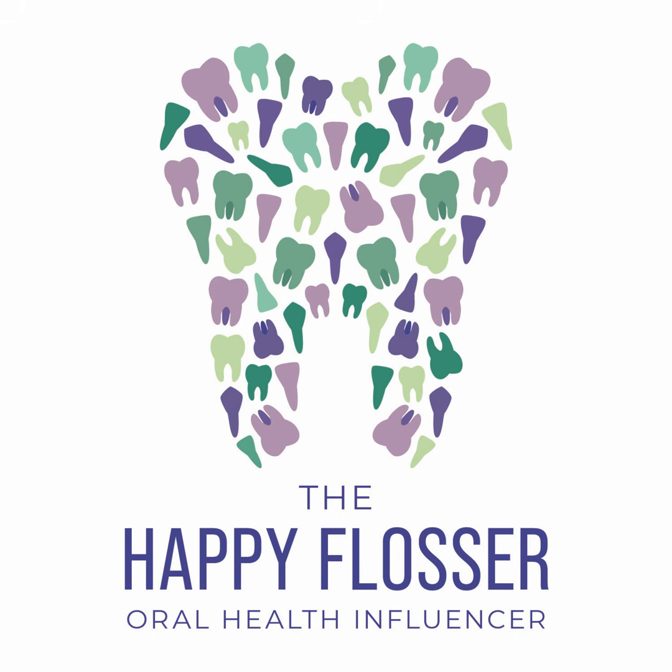And then you take your initial examination of your radiographs. Maybe you take a Panorex and a set of bitewings, depending on your patient's age and needs and risk assessment, your initial findings. You take a look at everything and you decide that your patient is not at high risk for anything. So let's just take a generalized look around. And when you're looking at your patient, you want to continue to have the curiosity, right? The curiosity of, is this normal? Are we within the normal limits? And what am I looking at here? Is this just a variant of normal when you're taking those radiographs?